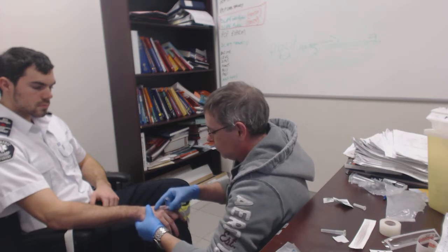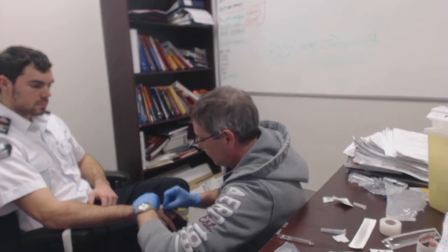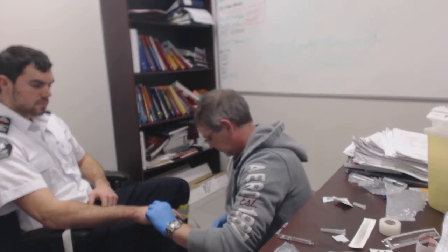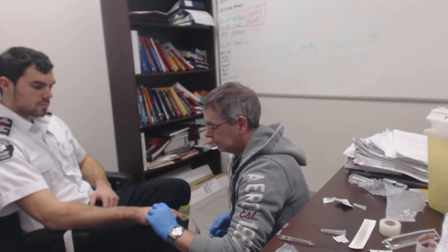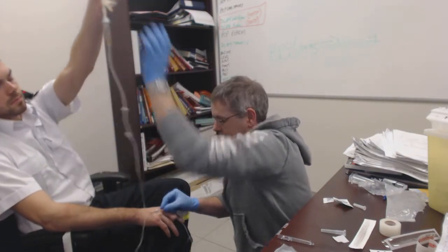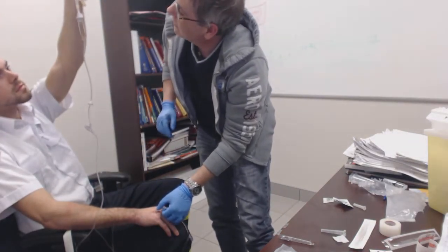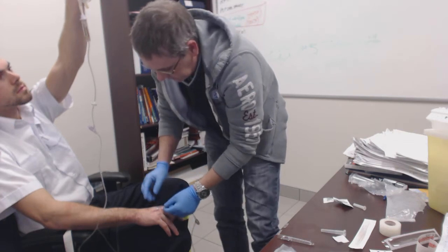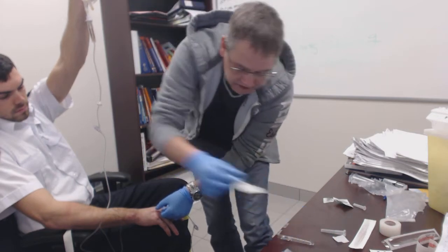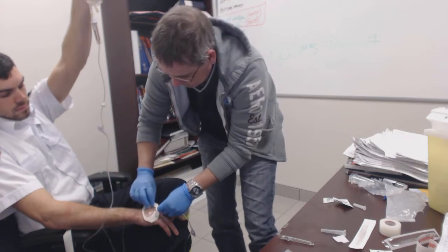Now I want to make sure that he doesn't bleed here, so I clamp that off. Secure my line. Now I'm going to put you to work here, Matt, and I'm going to get you to hold this up. And as the fluid's going in, give it a little squeeze. I can see that it's running. There's no bubbles here, so I know I'm in the right place. The fluid's going in. And then I secure.